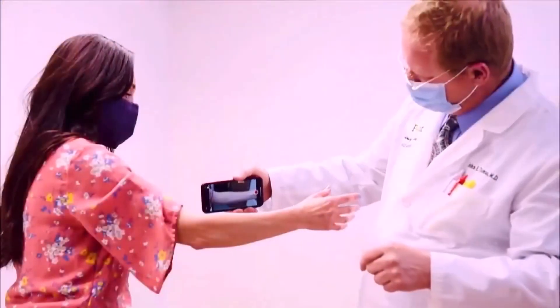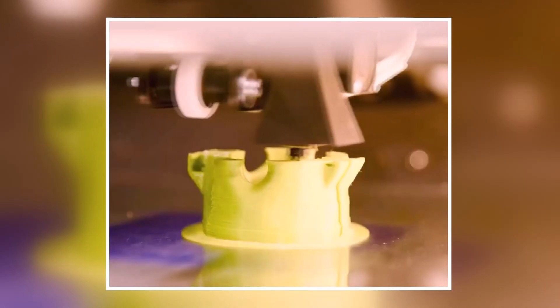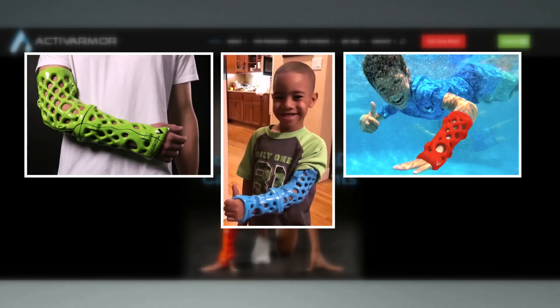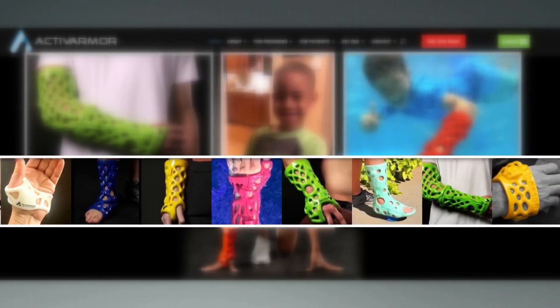Doctors simply scan her arm on a smartphone app and upload it to Active Armor, who prints the custom cast and overnights it back. There are waterproof casts out there, but they don't work as well as you'd think. This cast allows complete submersion, dries off, and can be removed and replaced at will by the patient.